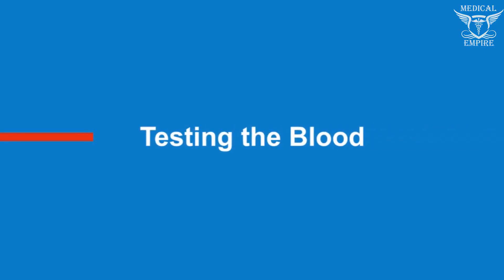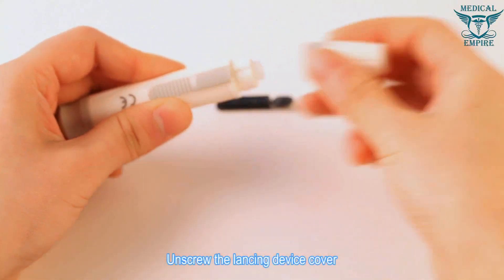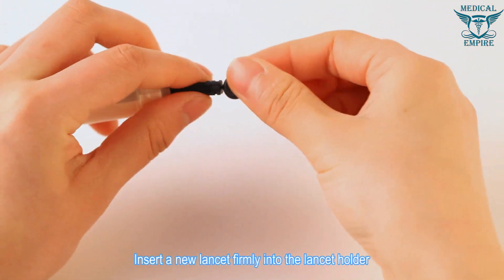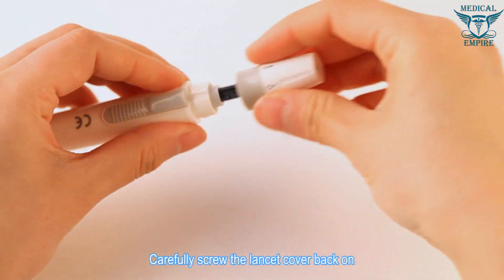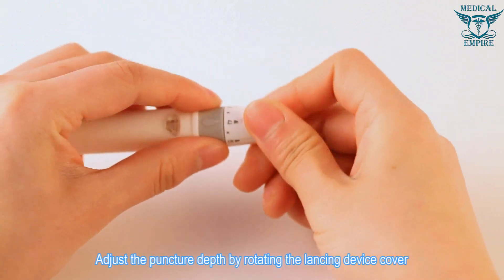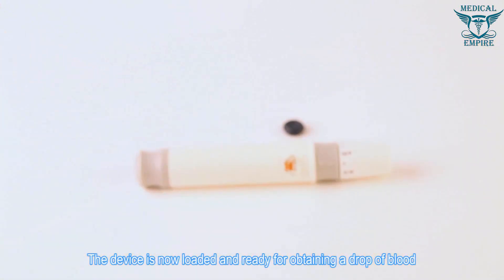Testing the blood: unscrew the lancing device cover and insert a new lancet firmly into the lancet holder. Twist the safety tab off, then carefully screw the lancet cover back on. Adjust the puncture depth by rotating the lancing device cover, then pull the cocking barrel back until it clicks. The device is now loaded and ready.